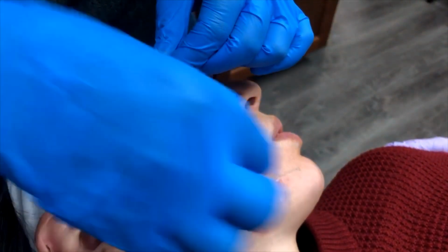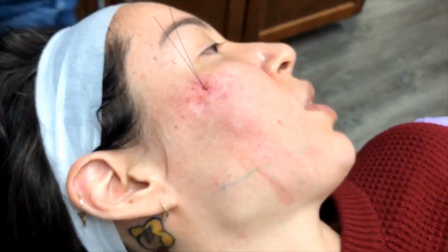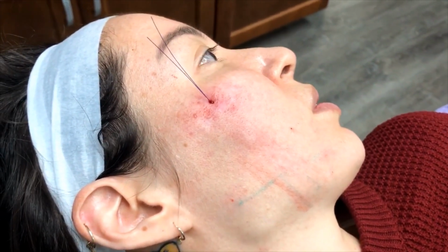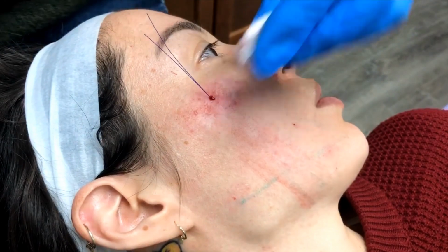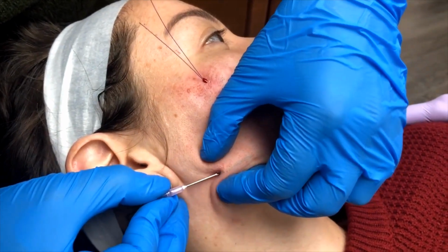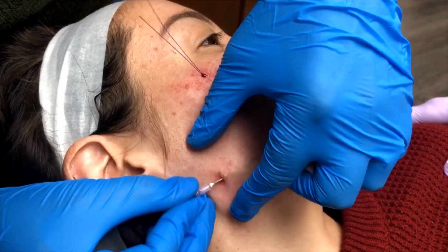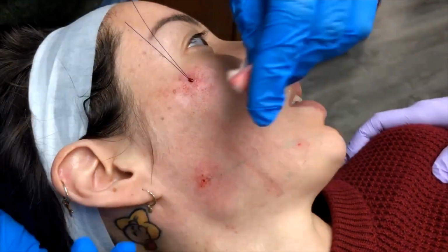And here we're going to go ahead and prepare a jawline thread, with a little bit of ComfortDocs needle with lidocaine 2% just at the entry and the end point there, so she's nice and comfortable. And now we're going to go ahead and repeat that procedure. The reason you can do it fast is you've got to get some great certification training with the AFE, and these are AFE techniques for sure to accomplish this.